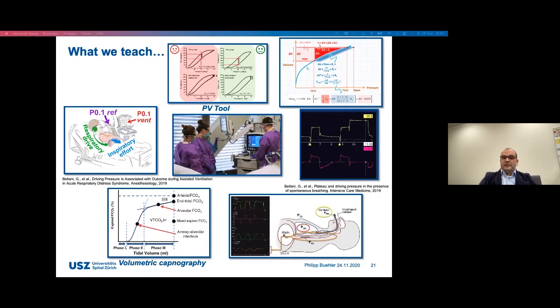What we teach additionally: we use a lot more teaching units in this part. We teach ways of measuring inspiratory effort, especially to prevent PESILI. We teach clinical signs of increased inspiratory effort.